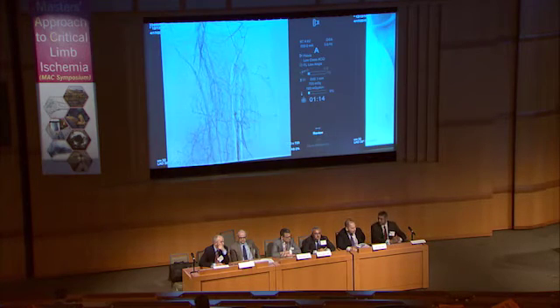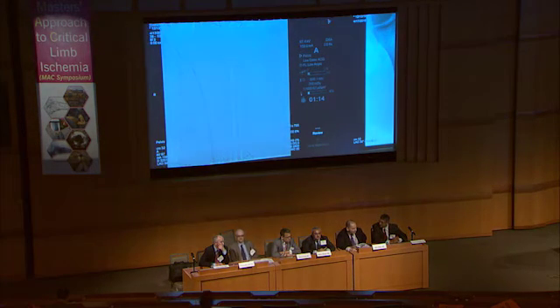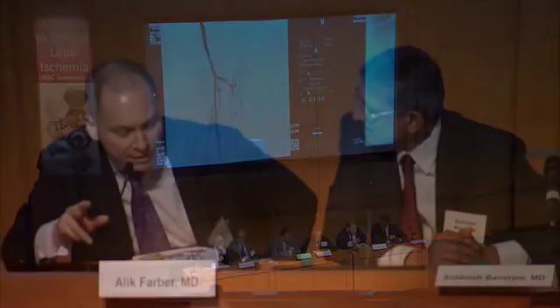Well, I think with angiography, you would selectively identify the branches, and there usually are several niduses. It may be more. It's just hard to know what we're dealing with. And then I would put coils at those niduses, and it's very difficult because you want to make sure that the coils don't embolize to the lungs. It's actually a quite complicated procedure.